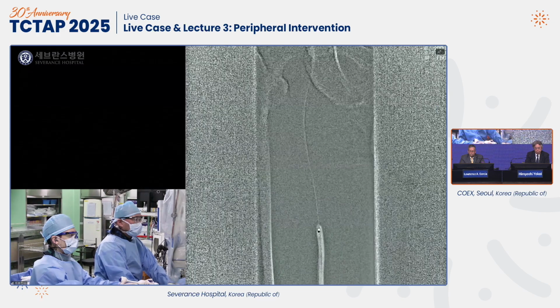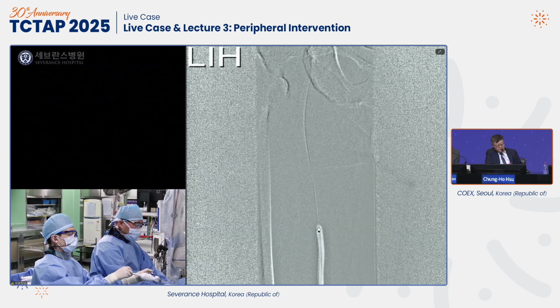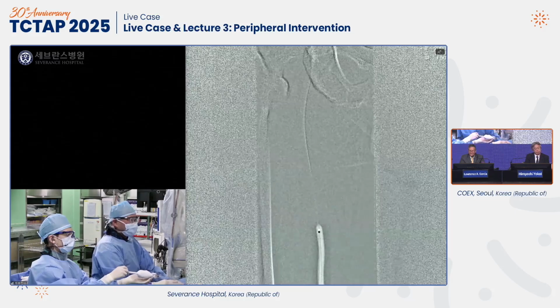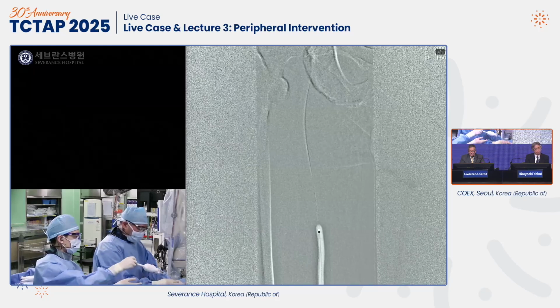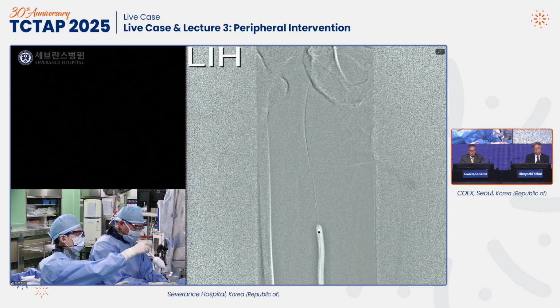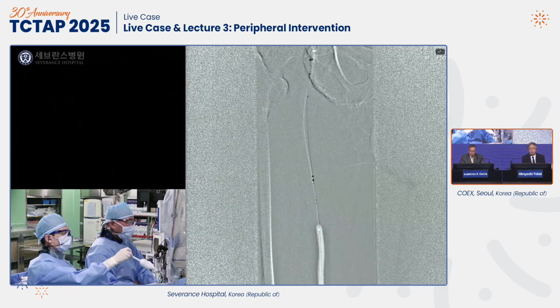Professor Ko, you don't have a long balloon for usual angioplasty, maybe 20 or 30 centimeters? A bit long. So 3 minutes. I usually apply 3 minutes for DCB. So do you apply longer time for inflation? You know, in the pivotal trials, at least in the U.S., it was 3 minutes for the total duration of drug dwell, and it worked.